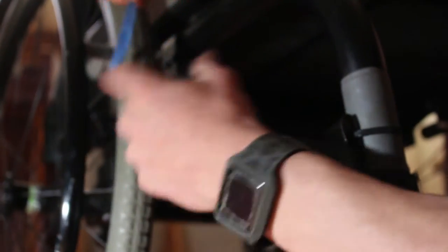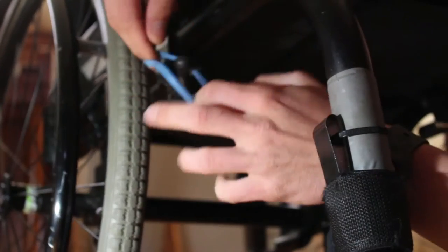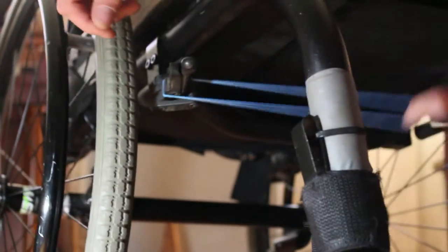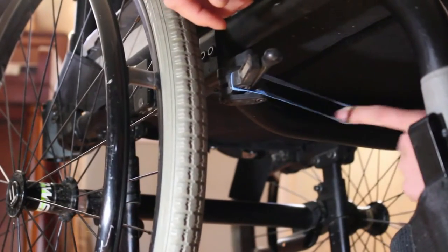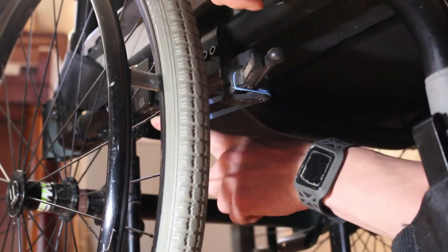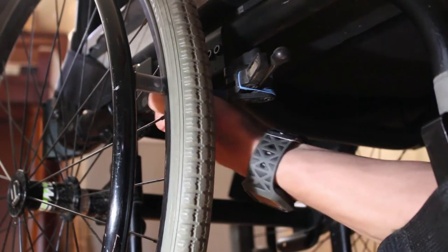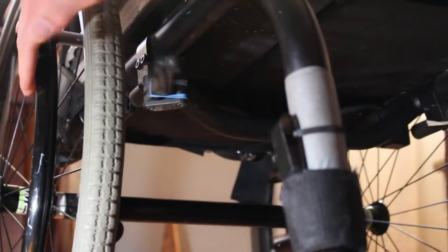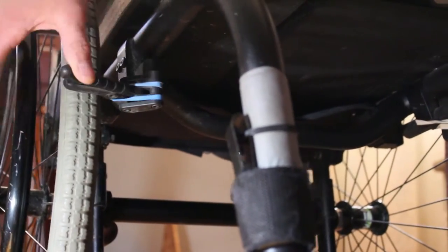Just take the rubber band, put it right over the top, just like that. Hook it right there. Then take it and push it back around the little mount pole, hook it on that, and just let it be. And then you're back in business.